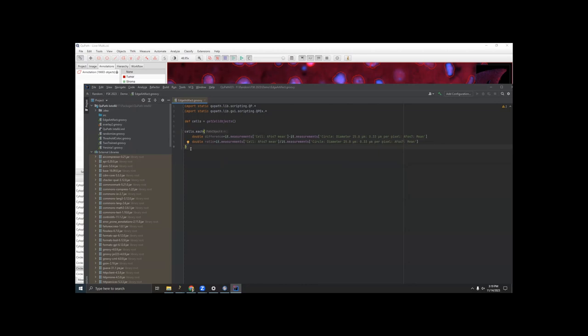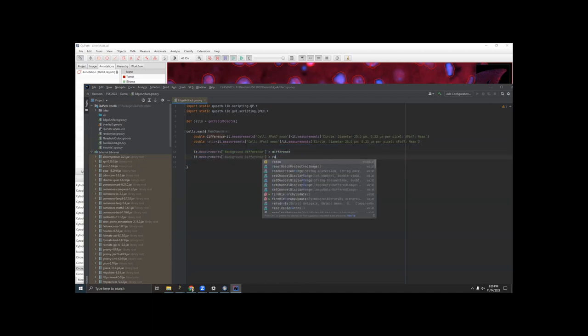Okay, now we've done the math, but we need to now reapply those values into the measurement list of every cell. And you add to the measurement list in the exact same way you read from it. So I'm just going to go it.measurements and give it a brand new name. I'm going to call this background difference. And let's do the same thing with the ratio.